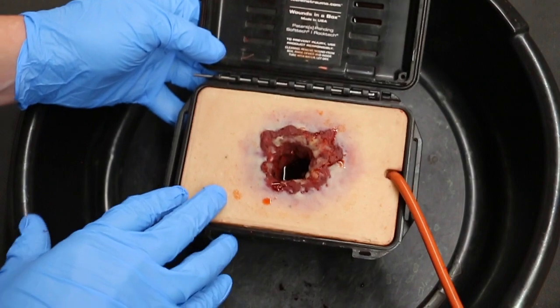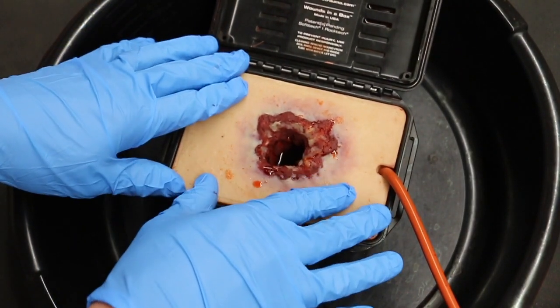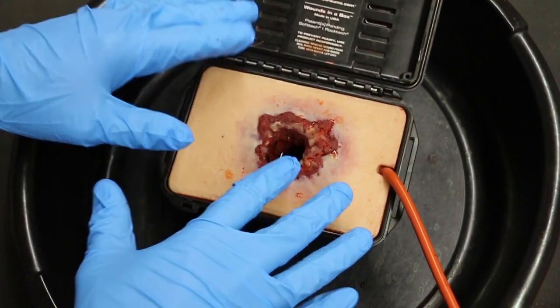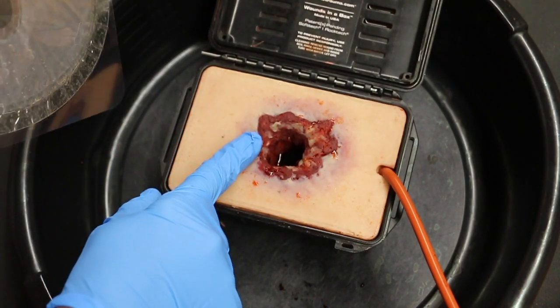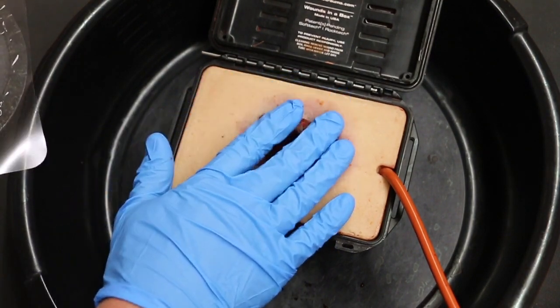So we have our Techline Trauma gunshot wound in a box. This is normally used for wound packing, but I do like to use it for chest seals because it does show blood coming out of the injury, and we can see our vents working. Hopefully this works. We'll give it a shot. So we have a gunshot wound. This is to the chest area, so we don't wound pack it. We just put a chest seal on it.